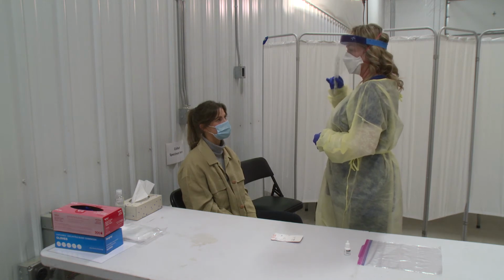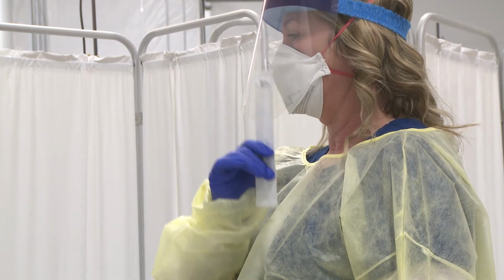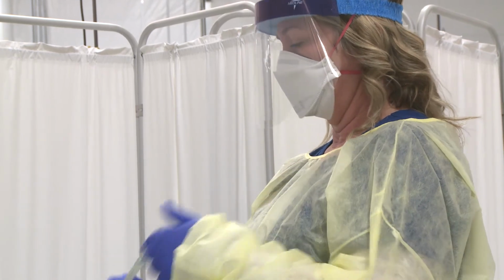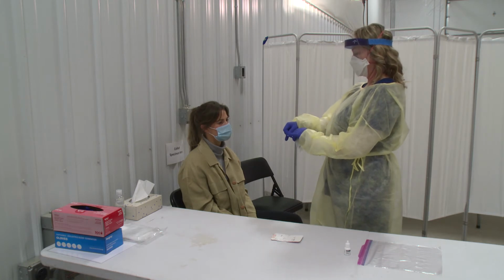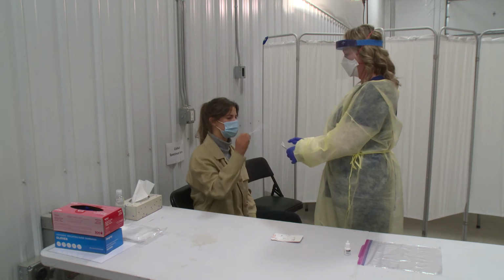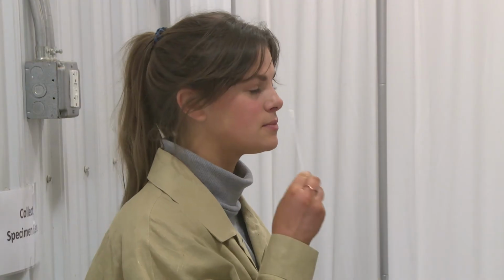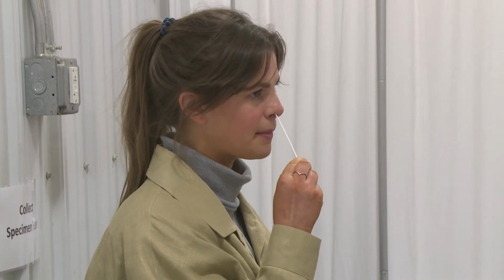To do that, they would need to first verbally and visually demonstrate how to perform the swab collection. That would include communication of, I'll open the swab for you, and with the sponge end of the swab, you would rotate it in your nose 5 seconds on one side and then 5 seconds on the other side. Once that's complete, I'll take the swab from you. But once the specimen has been collected, the swab would be given back to the medical professional.